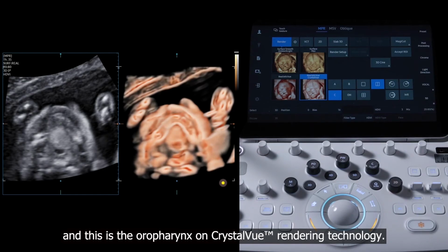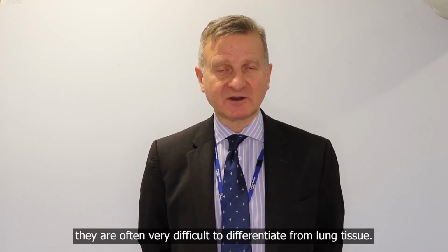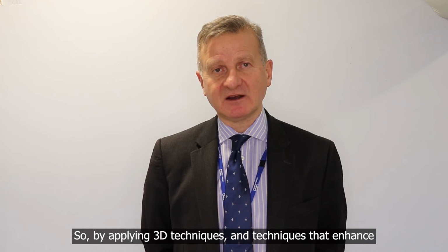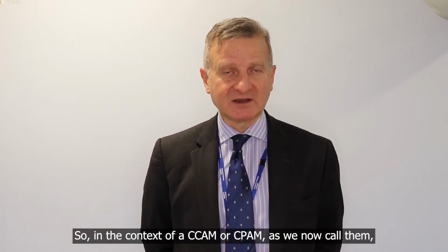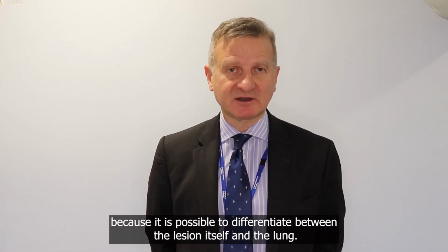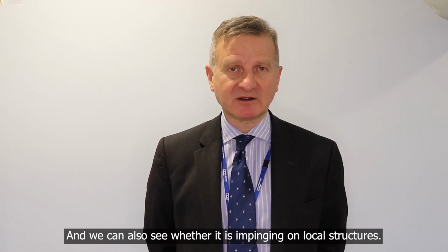If we look at the lesions in the baby's lung, they're often very difficult to differentiate from lung tissue. So by applying 3D techniques and techniques that enhance contrast between different types of soft tissue, we can then see both the extent of the lesion and its nature much more clearly. So in the context of a CCAM, or CPAM as we now call them, we can see how far the lesion goes within the lung, how much normal lung tissue there is, because it's possible to differentiate between the lesion itself and the lung. And we can also see whether it's impinging on local structures.